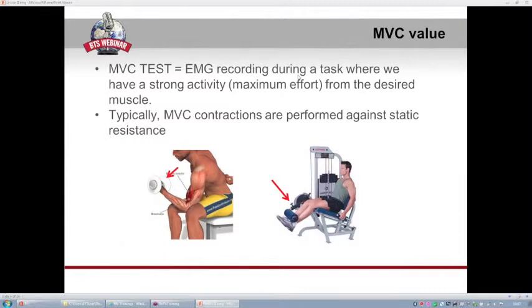The maximum voluntary contraction test has to be performed for each analyzed muscle separately. To perform this kind of test, some exercises can be arranged using belts in combination with manual resistance, for example, and also standard training machines can be very helpful to do that. You can use a repetition of maximum voluntary contractions, each lasting a few seconds, then relax and start again and so on, or you can use a single longer voluntary contraction.